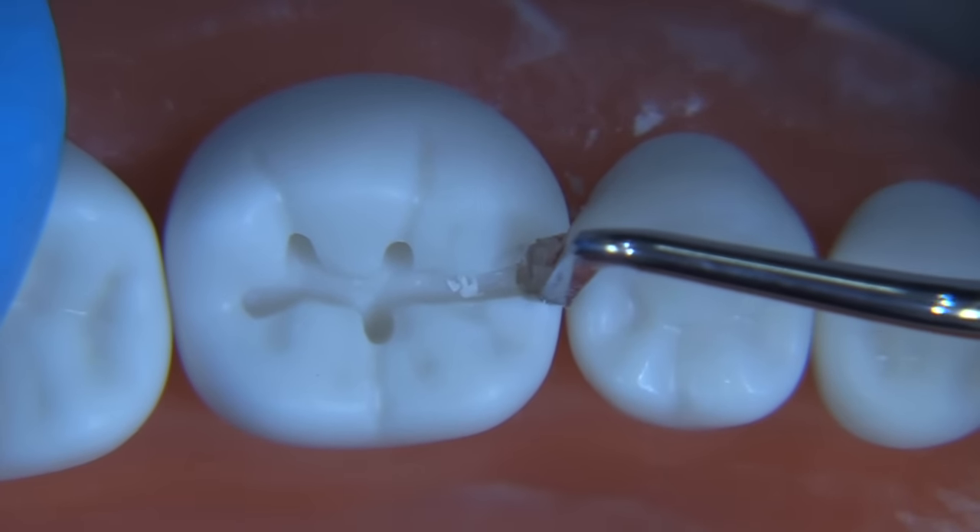This is a gingival margin trimmer — mesial — and we're going to place the axial pulpal bevel by starting in the middle of the wall buccal-lingually and pushing toward the lingual, almost twisting the instrument. This is how this instrument should be used — not dragged. When making the bevel in the other direction, take it in the middle and push in that direction to get the accurate axial pulpal bevel, which would be about 0.3 millimeters in width. For those who like to place gingival bevels — though I don't think they're always required as long as exit angles are strong and there's no undermined enamel — you can use the same instrument, starting in the middle and rotating it toward the lingual wall.